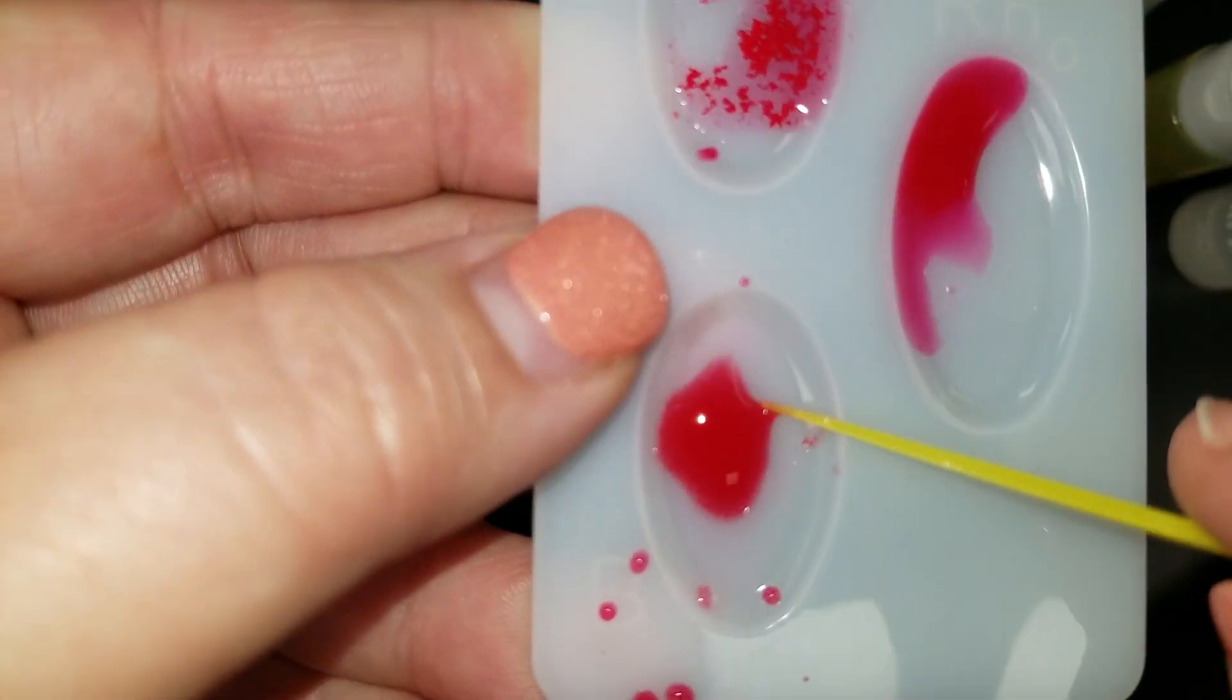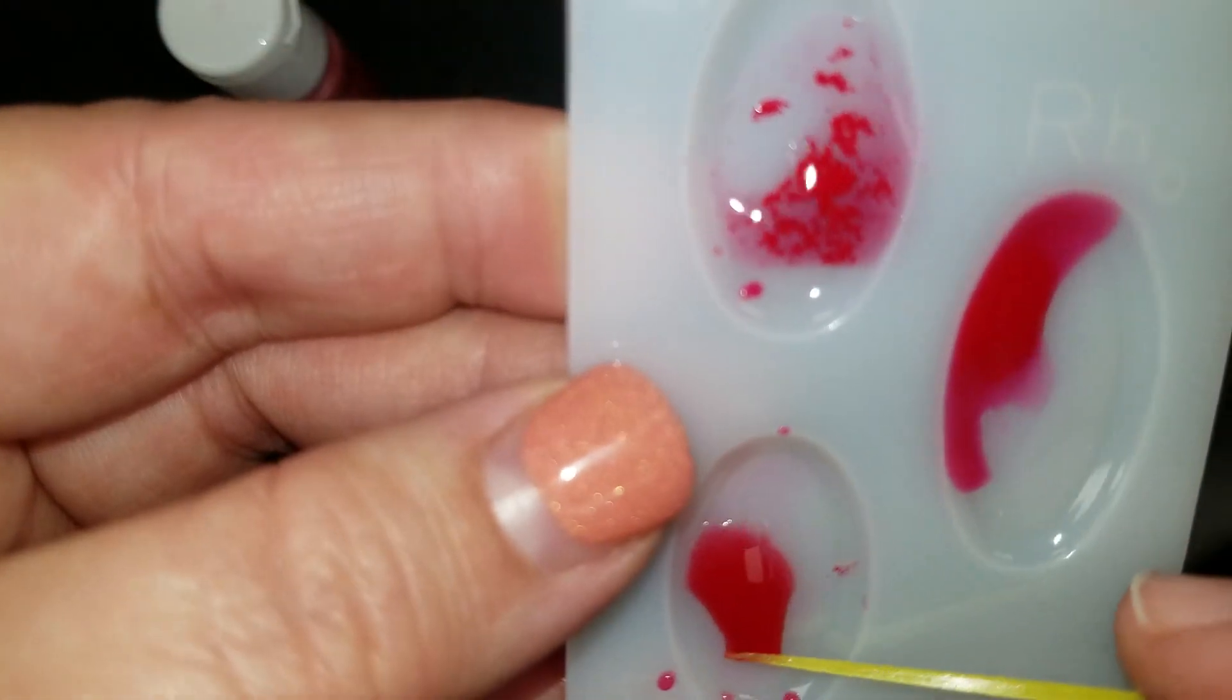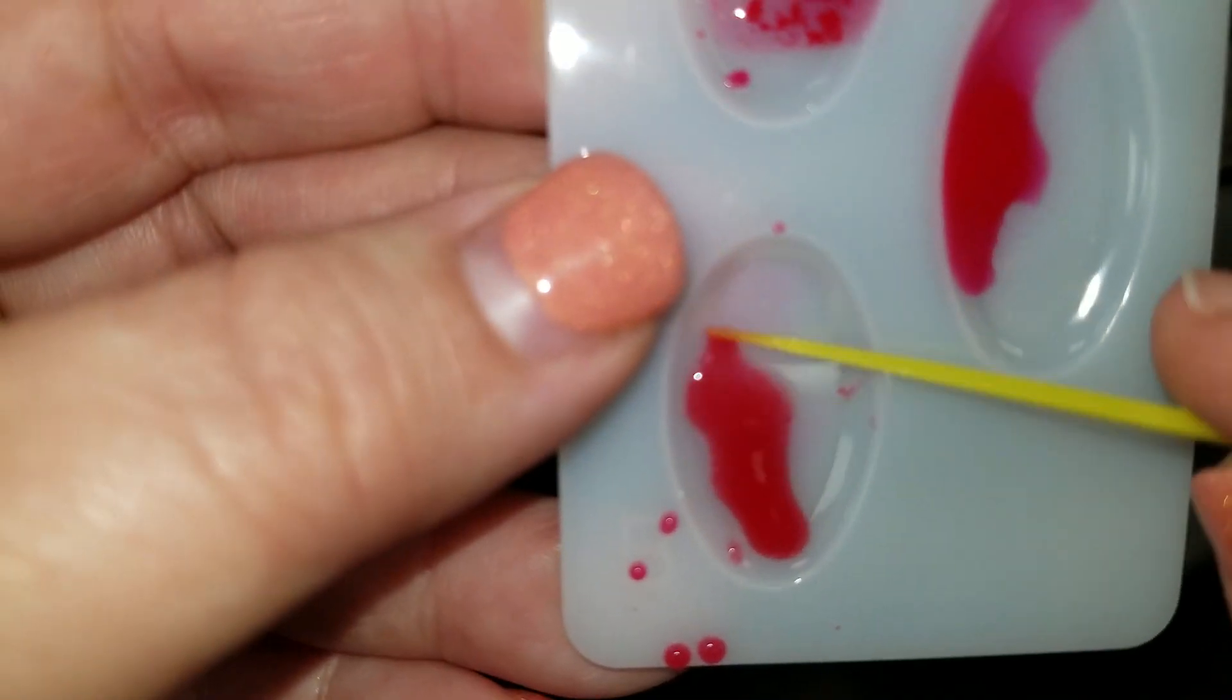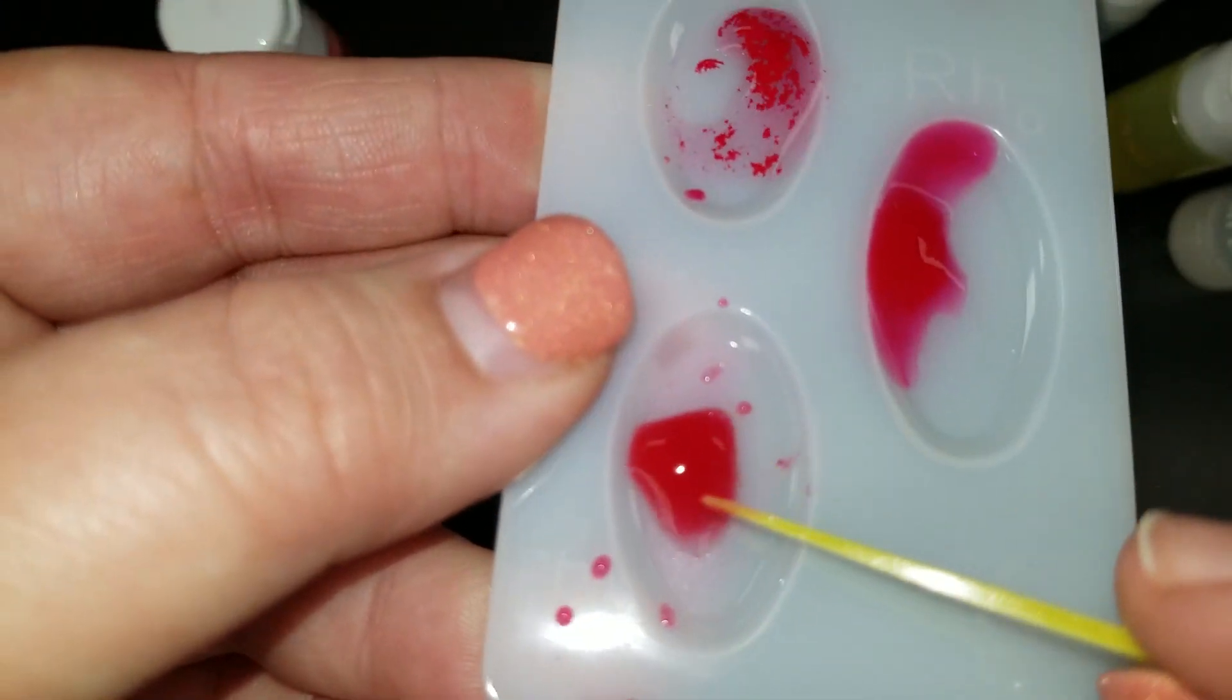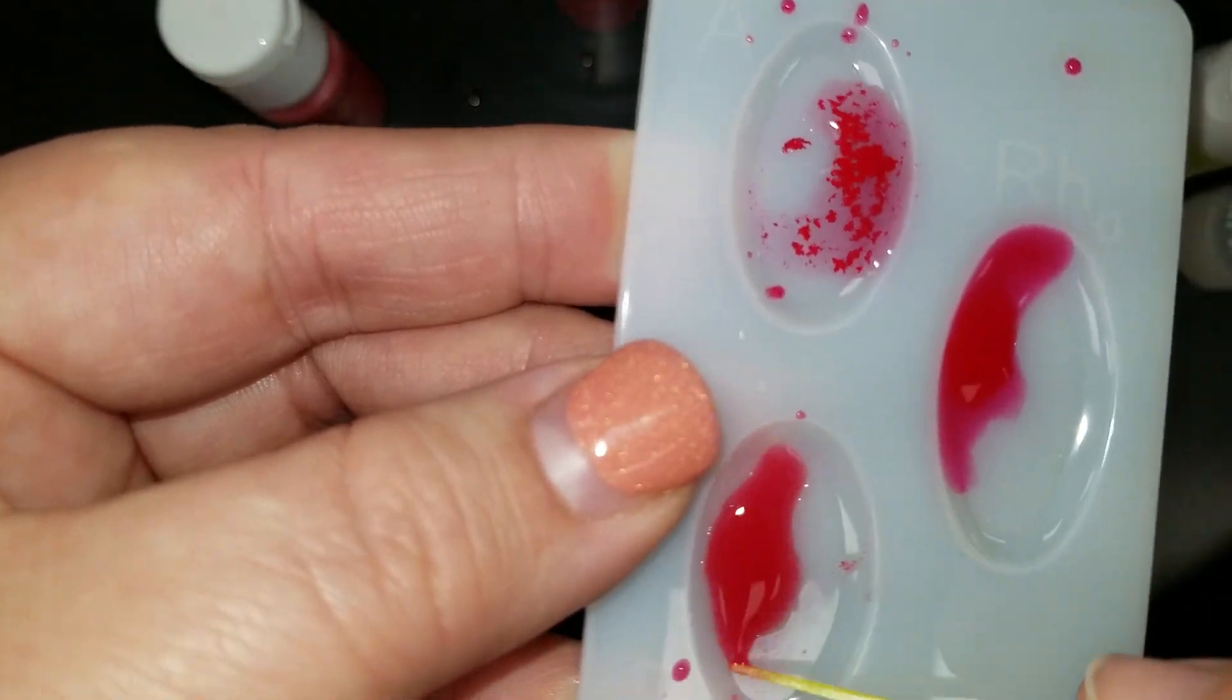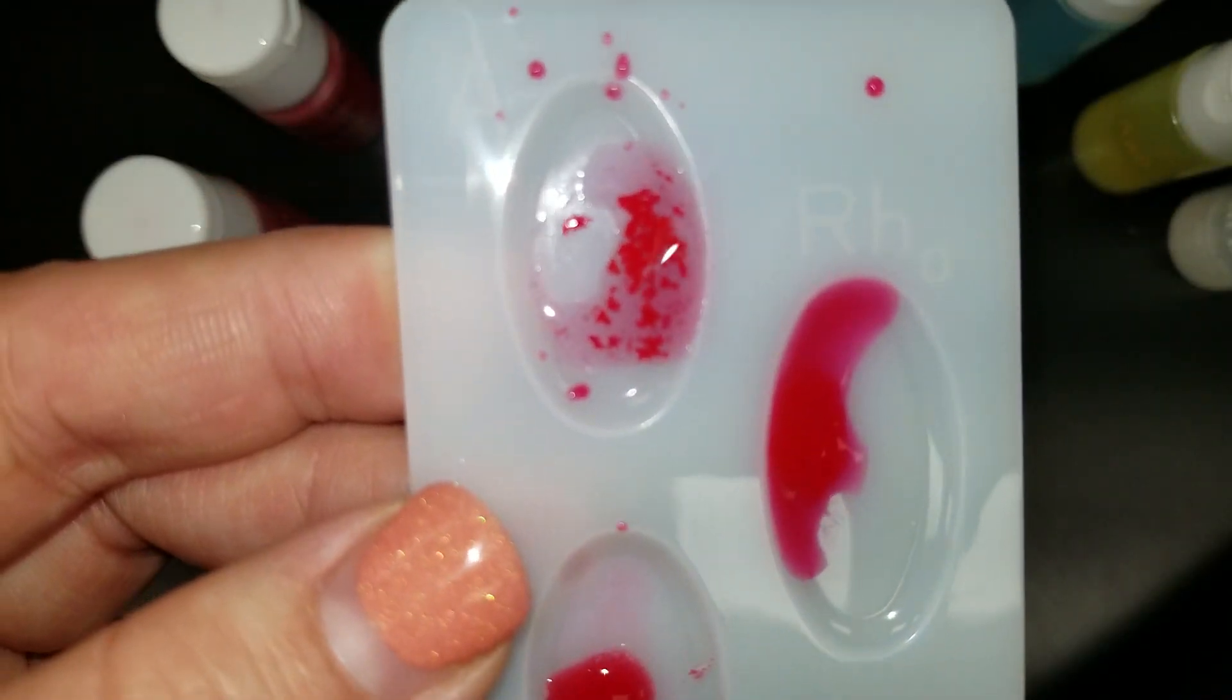It's not as clear a reaction as A, but if you sort of tilt your disc back and forth, you'll see that it's not just a nice clear liquid. There are these little red dots that are forming in there. So that would be a positive reaction for B, those little red dots that you see appearing in there. It's not just a fully clear red liquid, but we've got these little red droplets in there. So that's a positive for B. So she also has the B antigen.